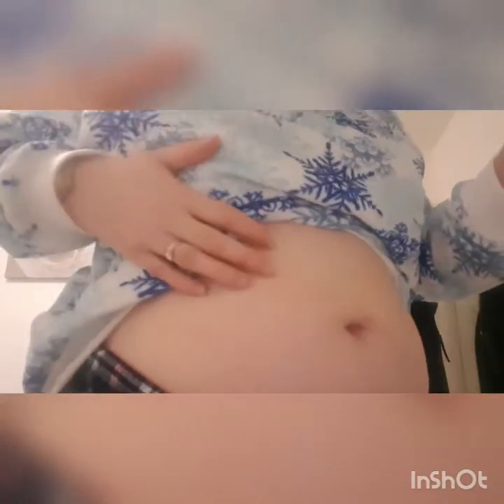I'm going to hold it for a second. Cetrotide has a habit of, when you pull the injection out, starting to spit some of the fluid out of the hole. So I have read and seen on YouTube videos, they say to keep the needle in for a few seconds and then just release. And there we go. All done. And it didn't bleed. Can you believe it? That's a first. Oh well, right, let's put this away then. So that is how you do a Cetrotide injection.